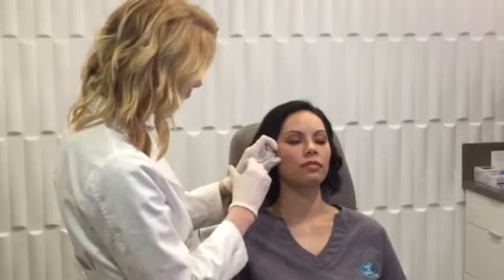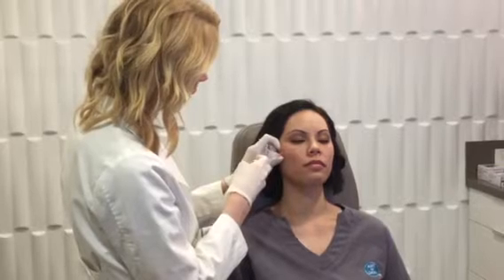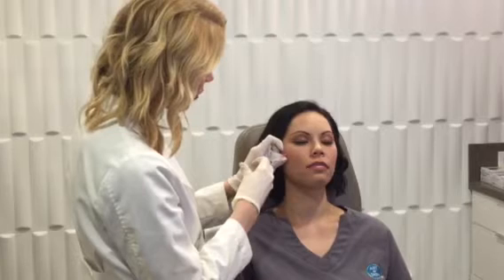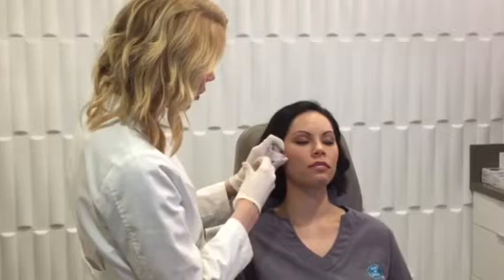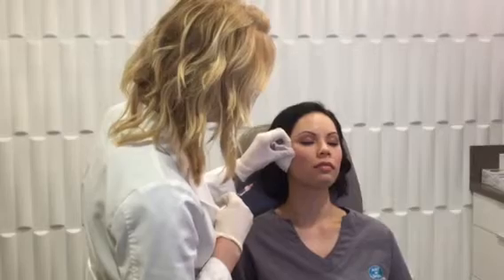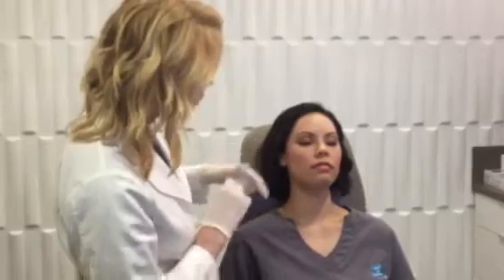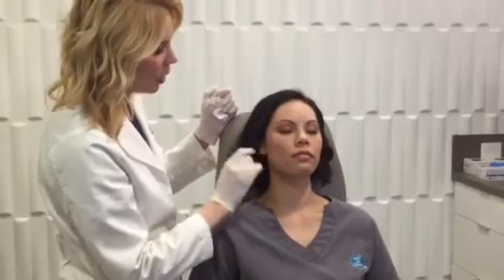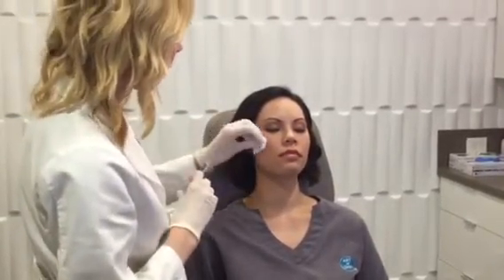So I'm going to do a little bit back, tracing her beautiful cheekbones that she's got here. And I'm actually refluxing each time. There are some important vessels. There's something called the transverse facial vein, and there's a matching artery that do like to wind around this area. So as a safety measure, I always like to check with patients and do a little reflux maneuver to make sure that we're not near an important vessel. So if you look at this side, the right side, compared to her left, she's got a little bit better projection, and we've just enhanced that apex of the cheek, or the top area of her cheekbone.